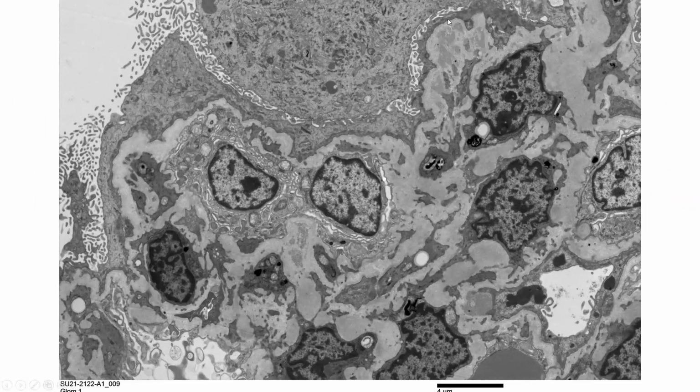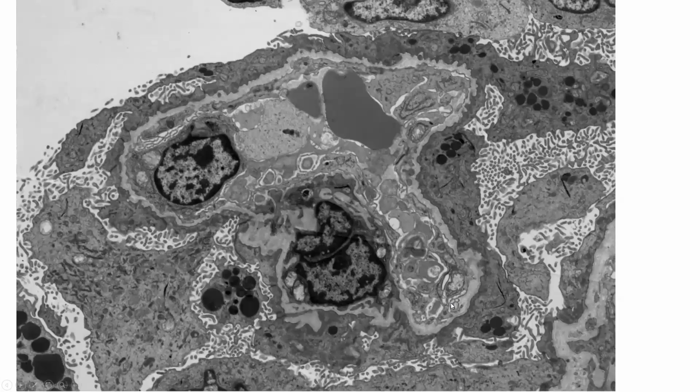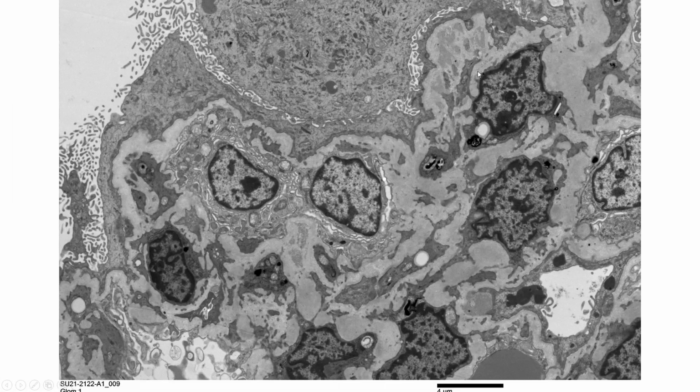Yeah, Robyn, this is Bazad. Fantastic case. Yeah, there is one there, and also a few here and there. So I was just wondering if there was a concomitant process going on. Well, that's an interesting question. Gosh, I don't know, and I don't think we saved frozen tissue. I think when the pathologist who got this explant came to me and said, "What do you want to do with this?" I said, "Throw some in glutaraldehyde," but it didn't occur to me to freeze any. We can do pronase digestion immunofluorescence here on the nephrectomy specimen if we want.